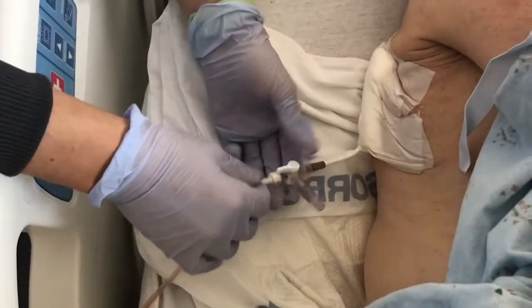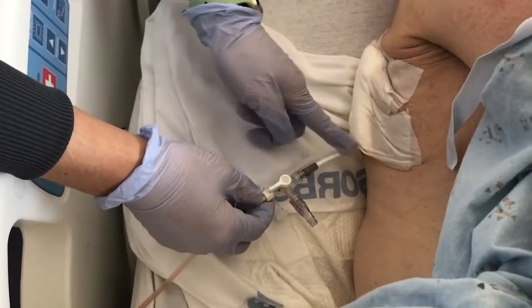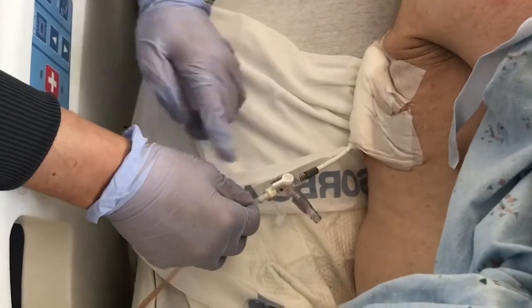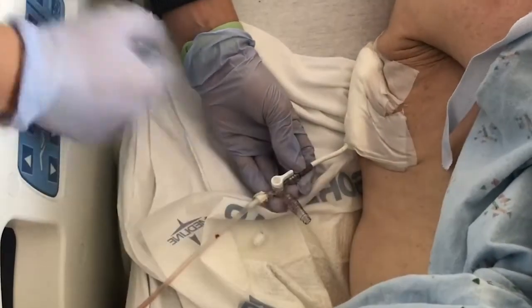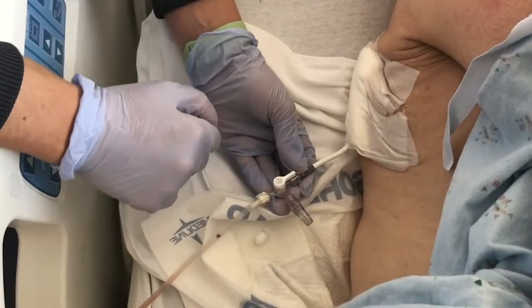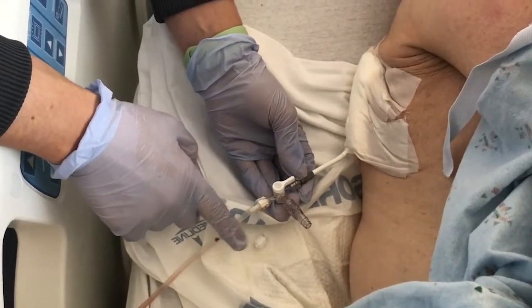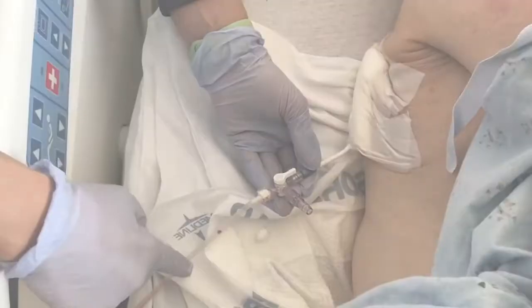You leave the chest tube closed — as you can see, the only ports that are open are the chest tube itself and the side port, but since there's nothing attached there, it's okay to leave it this way, or just off to the patient. Let it dwell for one hour, at which point the nurse has already been instructed to come and open it, turning it 90 degrees so that this channel again flows through.